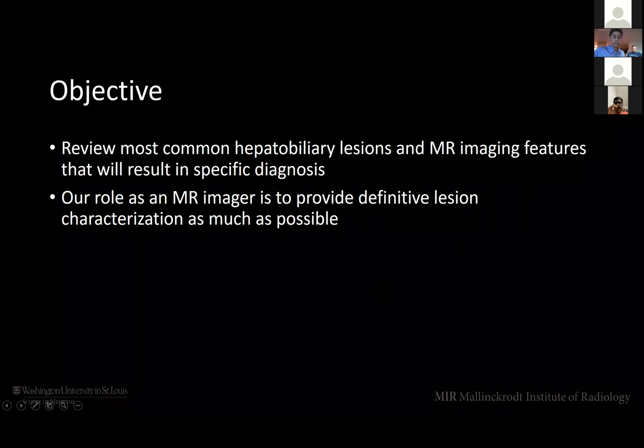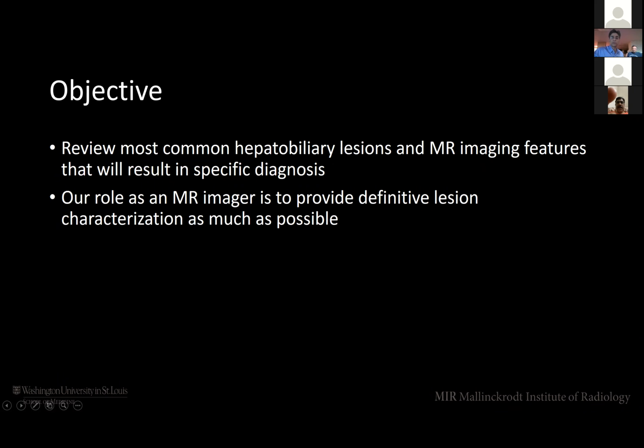So the objective for this talk is to review some of the most common biliary lesions and MR imaging features that will help us make a specific diagnosis. This is by no means a comprehensive lecture. I'm not covering all the lesions.